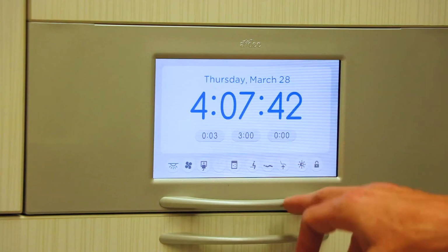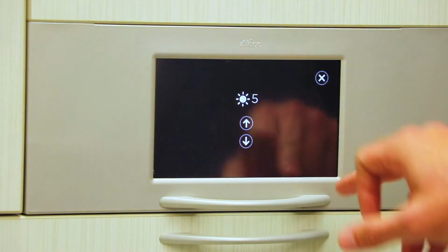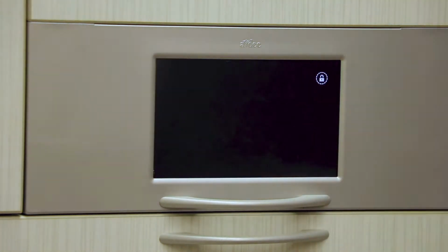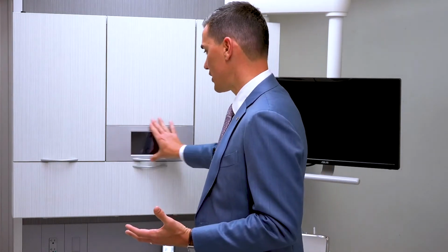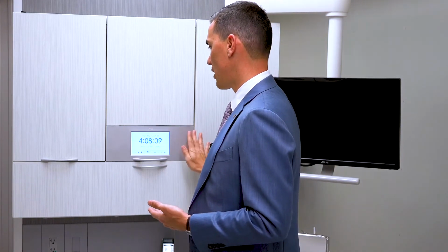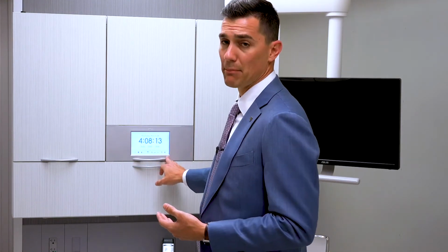Next to that, we have the ability to adjust our brightness and contrast if we would like, just by hitting the up and down arrow. And then the last button we have is basically a lockout button. It's a 15-second lockout, and what that allows us to do is if we need to rebarrier or we need to clean that screen with anything that you would clean your cell phone with or your monitors on your TVs or anything like that, that's what we would recommend to clean that screen. But if you need to rebarrier, pull that barrier tape off and then put that back on without touching anything, you could lock yourself out by holding that button down.